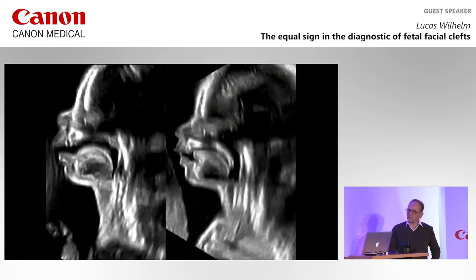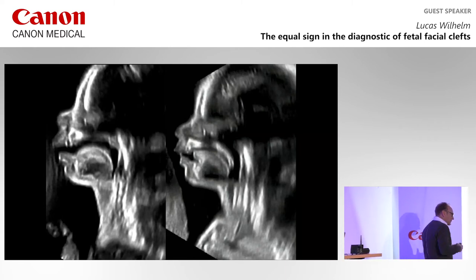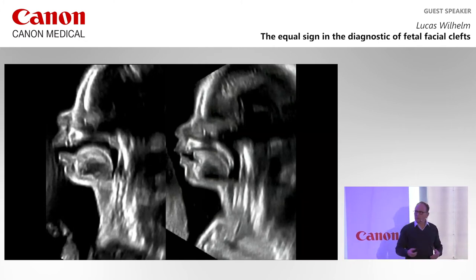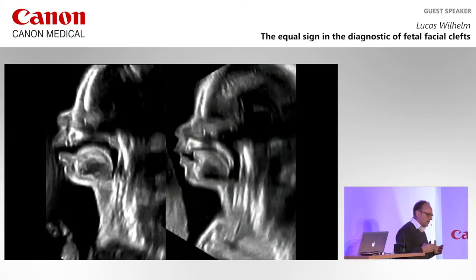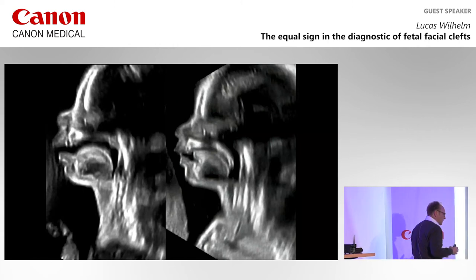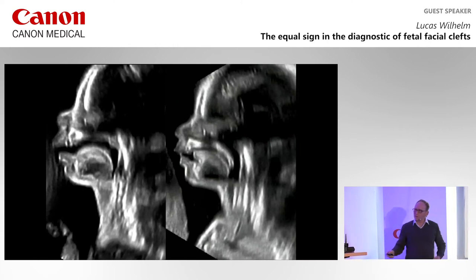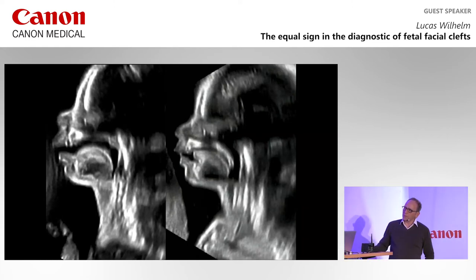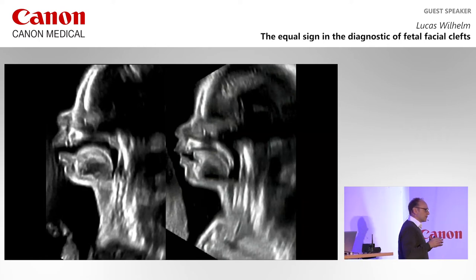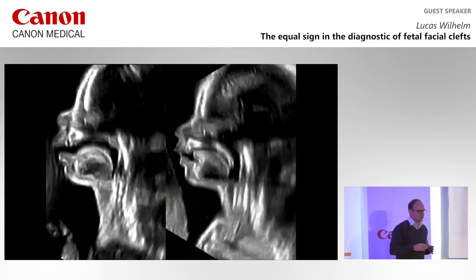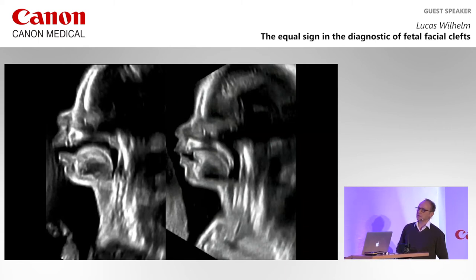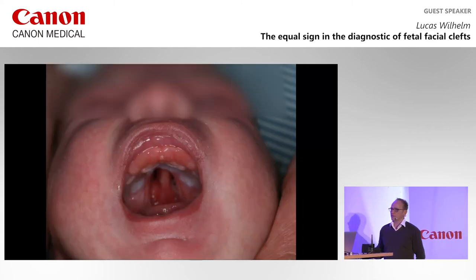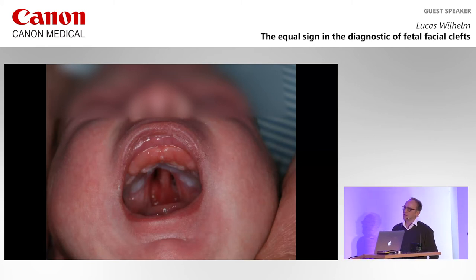What you also see in this case is a normal position of the tongue. That's very important for post-partum treatment because not all fetuses with isolated cleft palate have glossoptosis and a respiratory problem after birth — it's more a function of the mandible. If the mandible is quite okay and the position of the tongue is okay, you don't have to expect a respiratory problem after birth. You can clearly diagnose isolated cleft palate. After birth, it was confirmed: hard and soft palate cleft.